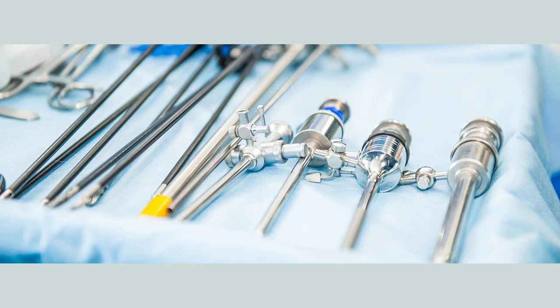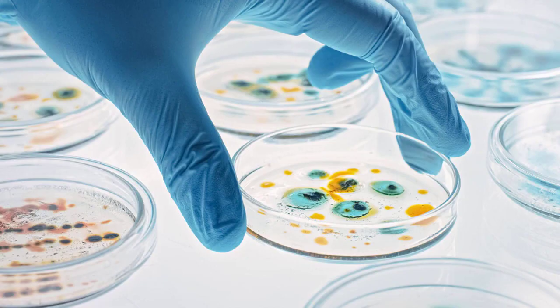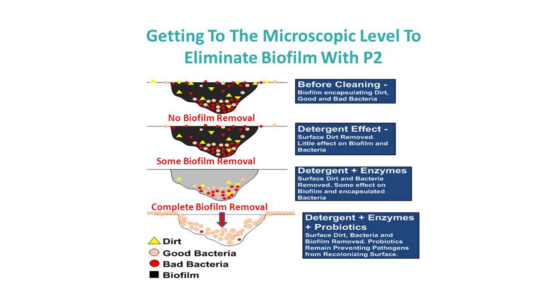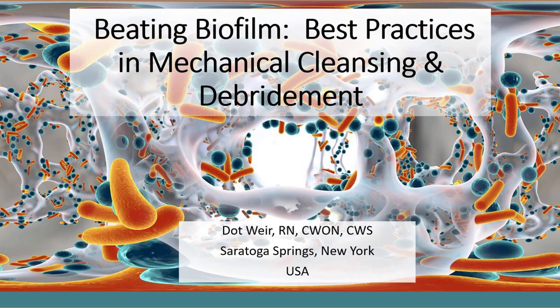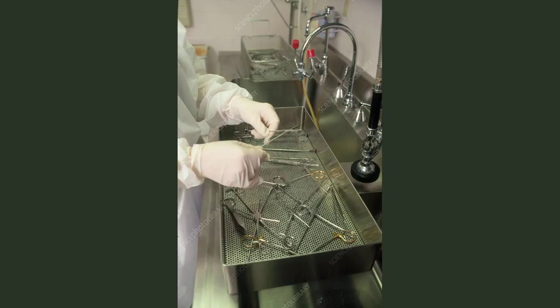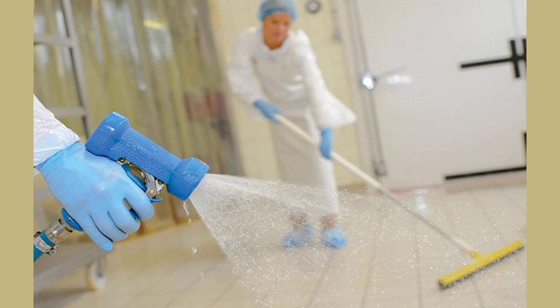The same concept goes for surgical instrument cleaning, too. Tools with odd shapes are much more likely to remain contaminated. For instance, medical forceps have serrated jaws, grooved ratchets and a hinge connecting the two sides, perfect places for microorganisms to hide. While biofilms are notoriously difficult to eliminate, there are multiple ways to prevent them from forming and get rid of them once they appear.